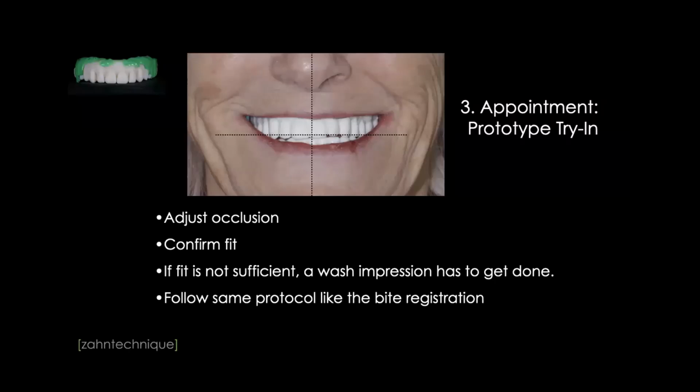It's very helpful. What did Oscar say today? You're pipping it? Yeah, exactly. What is pipping? So PIP paste. PIP paste is important to check the fit on the intaglio of a denture or denture base, so you can make any adjustments.